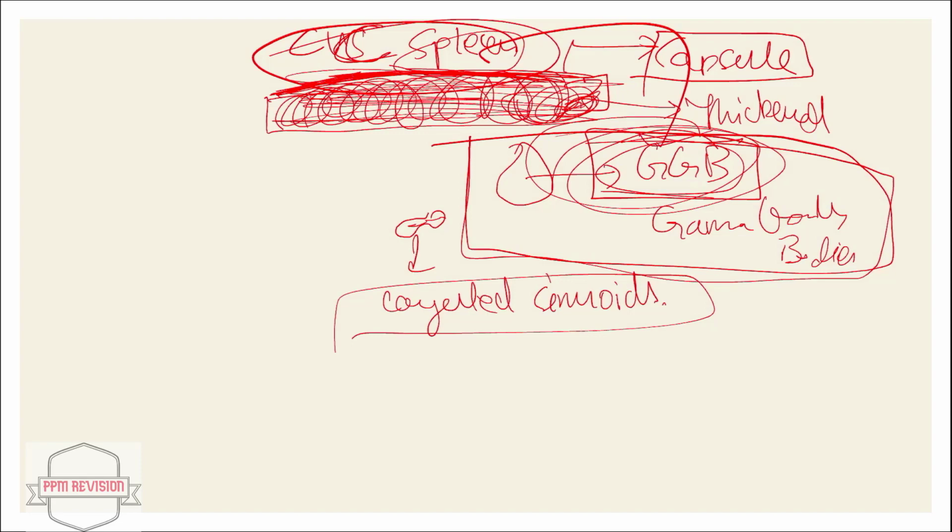Now looking at CVC spleen, to note a few points. There's presence of dilated and congested sinusoids with increased amount of blood in the pulp. There's thickened connective tissue, trabeculae, and the walls of sinusoids. There are hemosiderin-laden histiocytes in pulp tissues and sinusoids. And Gamna-Gandy bodies, which are nothing but fibrotic nodules with iron and calcium deposition, may be occasionally seen.